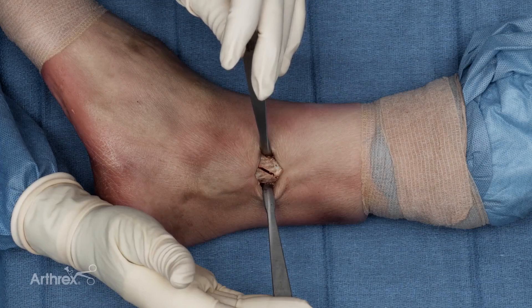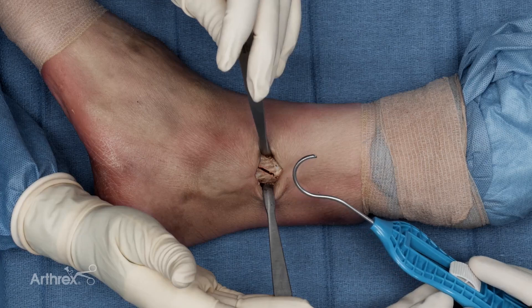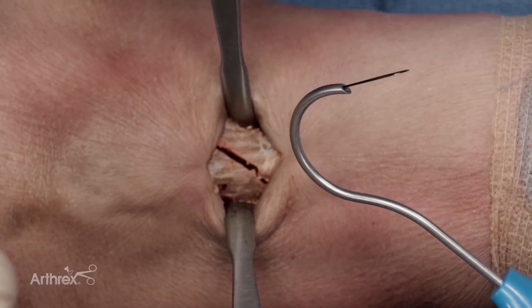For this technique, to pass the fiber tape cerclage around the fracture, I use the blue disposable fiber tape cerclage passer. This also comes preloaded with a nitinol loop to facilitate passage of the fiber tape cerclage.